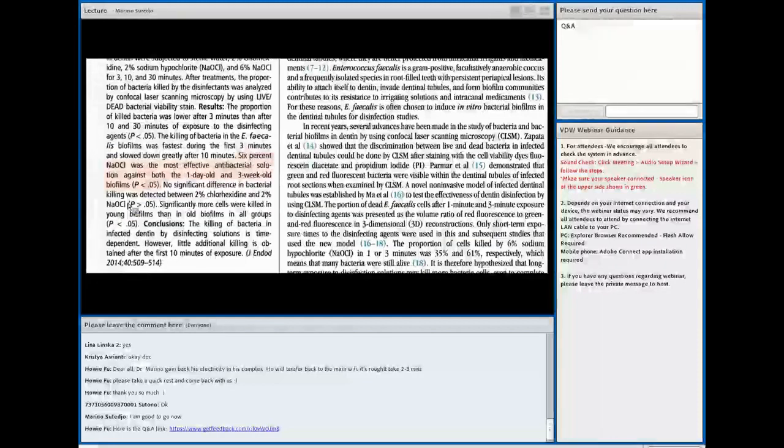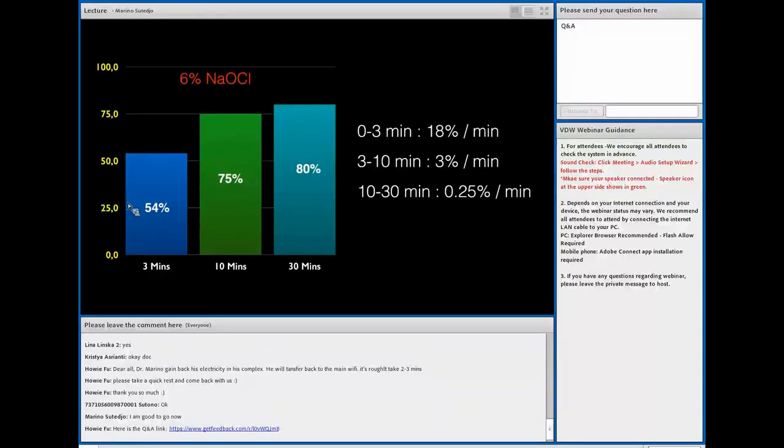So as I mentioned before about the concentrations, the higher the concentrations, the better it is. So I'm suggesting you to use the higher concentrations of sodium hypochlorite. I'm using 5.25%, but sometimes I can buy the 6% sodium hypochlorite, because there are not many factories that sell 6% sodium hypochlorite for endodontic indications, but if there is 6%, then definitely I will use my 6%. But not just the concentrations that I found interesting in this paper.